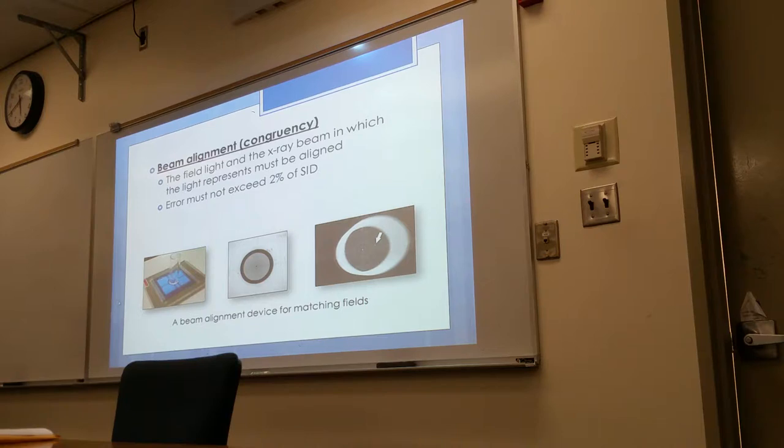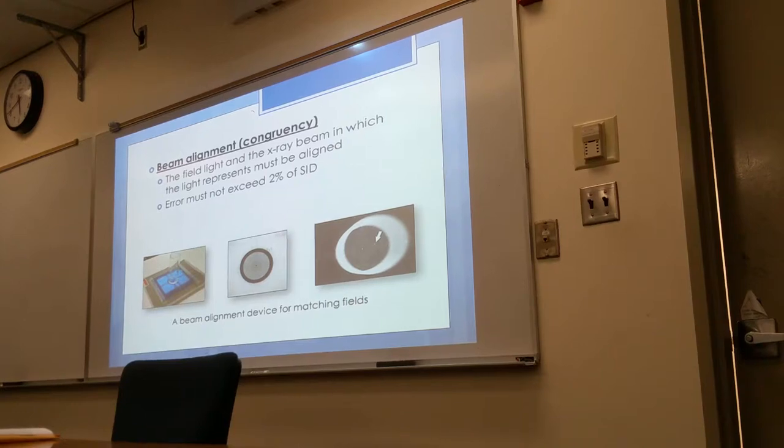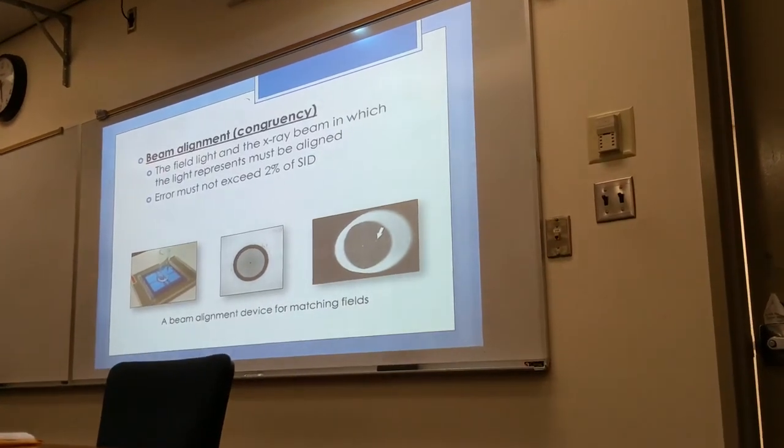Any questions here? Yes. As far as the SID, because of the wear and tear of the machine, would that change a little bit with the SID? Increasing or decreasing? Okay, I don't think I understand your question. Because of the wear and tear of what? Of the machine, of the tube. Okay. Would that affect the exposure?